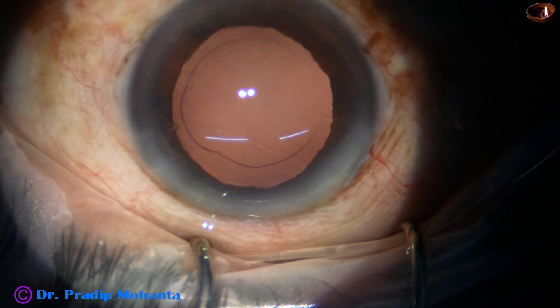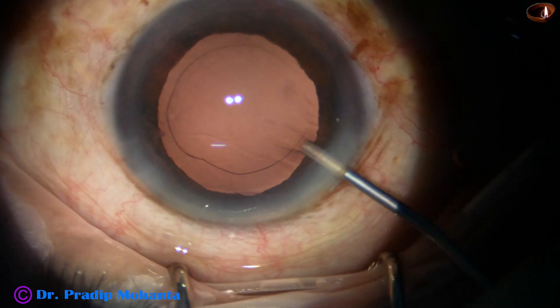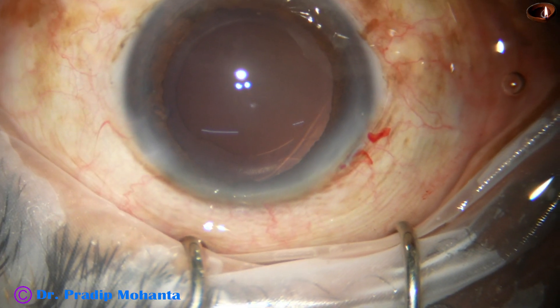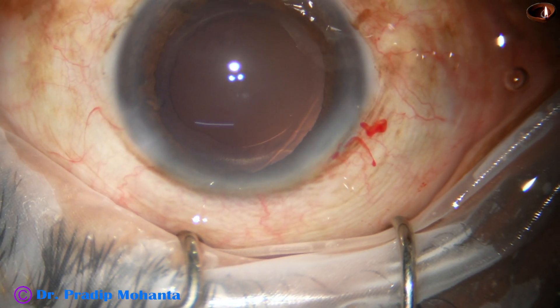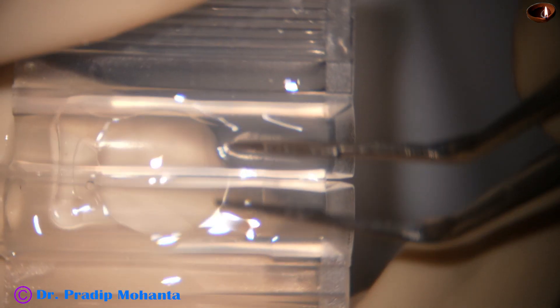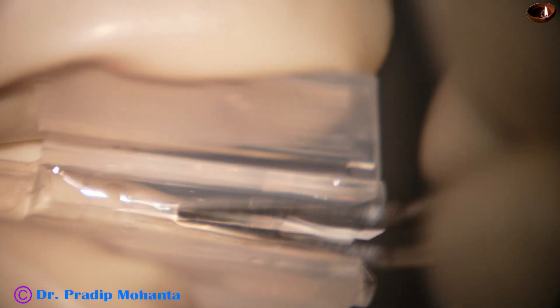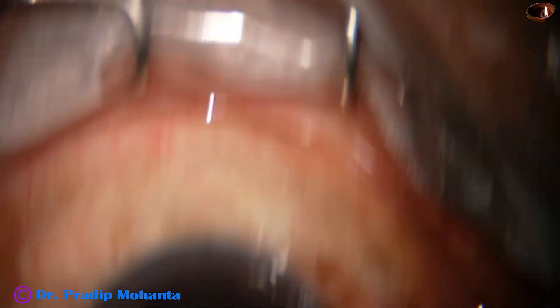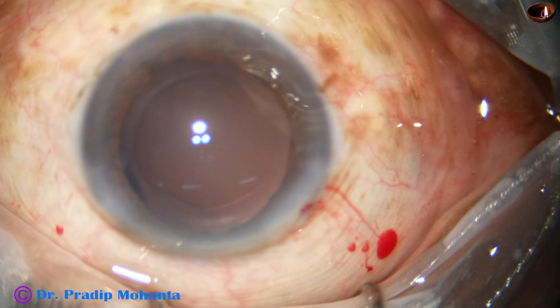Now, implantation of the intraocular lens. This is visco filling up the capsular bag and the anterior chamber. This is the Asfina 404 from JAIS — a plate haptic intraocular lens. This cartridge is provided by the company JAIS. It is placed and loaded, and this goes through the 2.8 millimeter wound, but the wound is stressed.